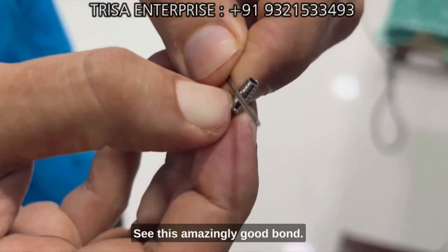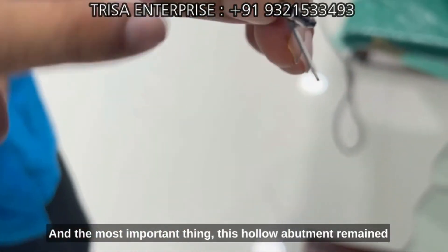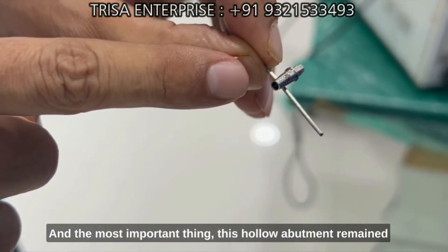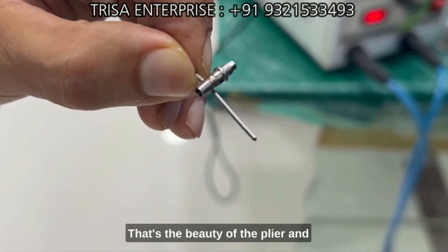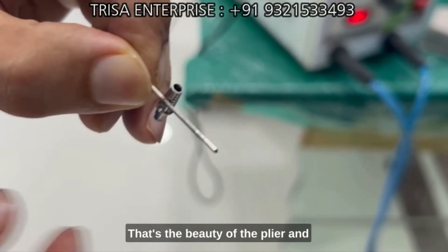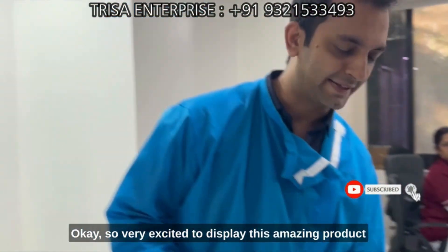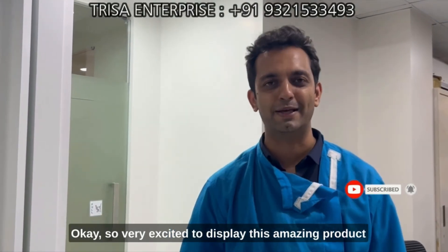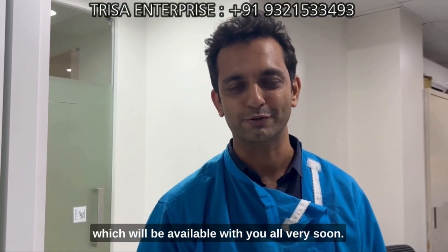Look at this welding — an amazingly good bond has been achieved. Most importantly, this hollow abutment remained hollow — it did not get compressed. That's the beauty of the plier. Amazing bonding achieved! Very excited to display this amazing product, which will be available with you all very soon. Thank you.